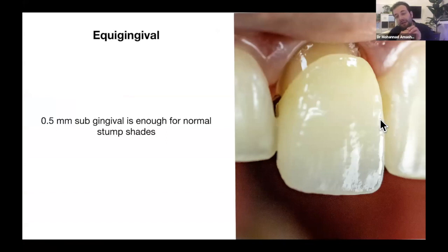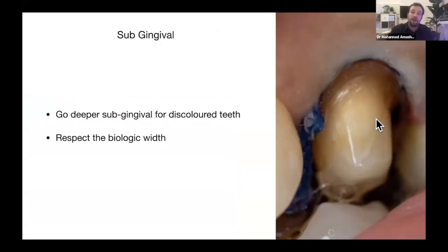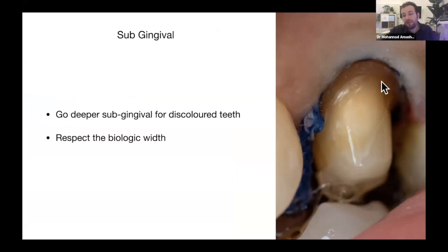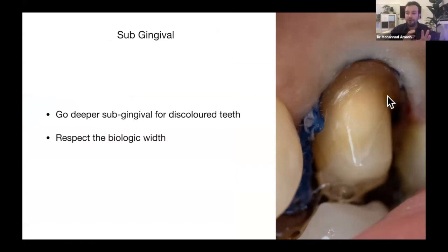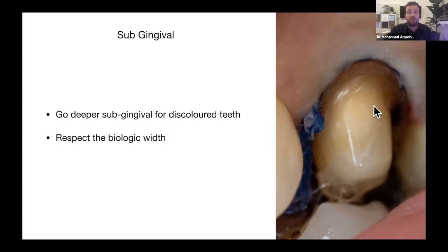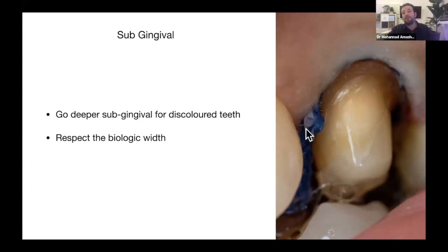Going 0.5 mm below the gingival margin — slightly subgingival — is ideal when you have a nice tooth color, hiding the transition between tooth and ceramic inside the gingiva where nobody can see it. But if you have a heavily discolored tooth, you may need to go deeper — sometimes 1 mm to 1.5 mm subgingival — because the dark tooth can show through the gingiva. Always respect the biologic width.